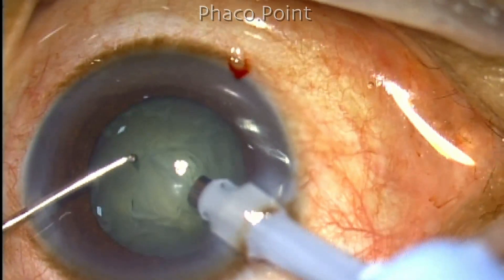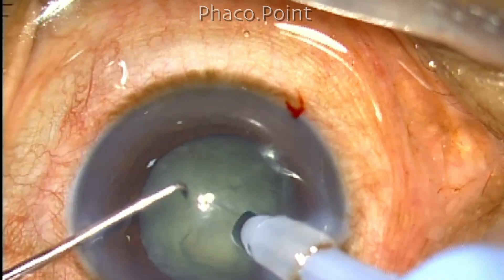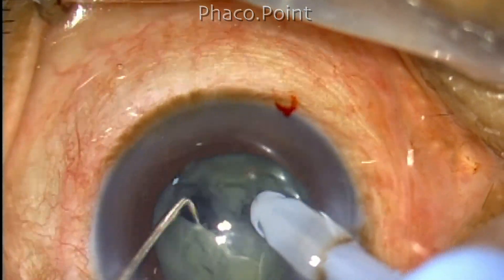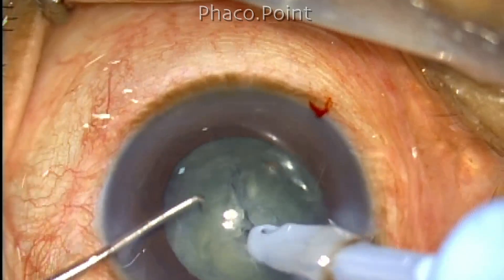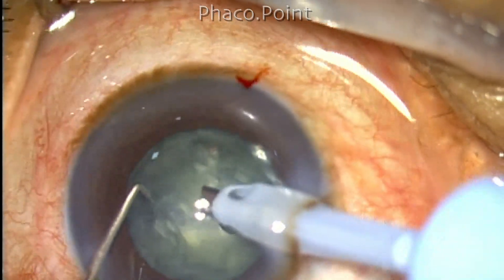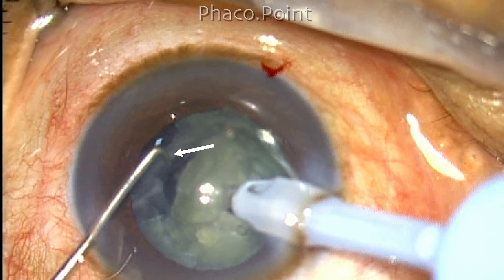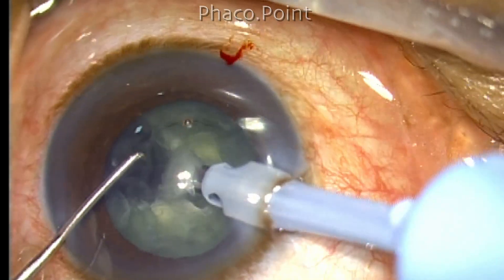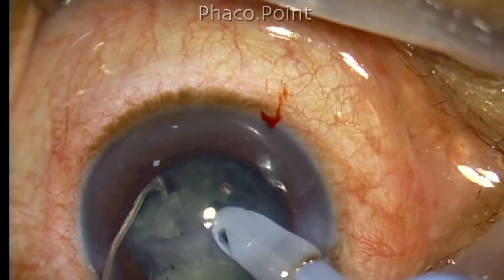Let us come back to the original case. The procedure I am following is a direct chop, which is my technique of choice for almost all grades of cataract. I impale the phaco tip into the nucleus core and create the chop, but I find the nucleus is not rotating. We have two options: either repeat the hydrodissection, which will be difficult due to ruffling of cortex. So I try to do an in-situ chop, and at this point I see that the hydrodissection wave has actually passed between the epinucleus and endonucleus junction — the epinucleus shell is still left behind. This clearly shows the plane of hydrodissection was not in the cortical cleavage plane at all.